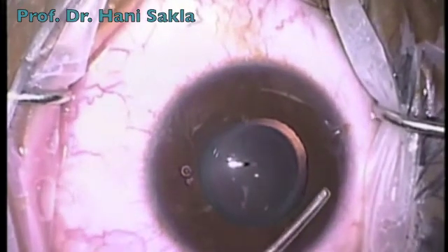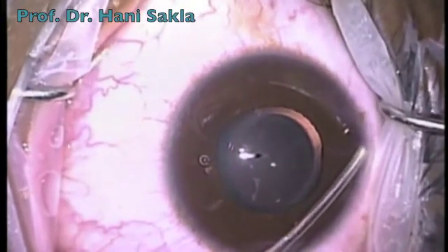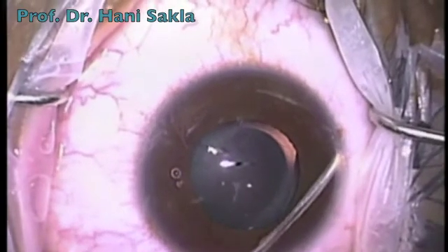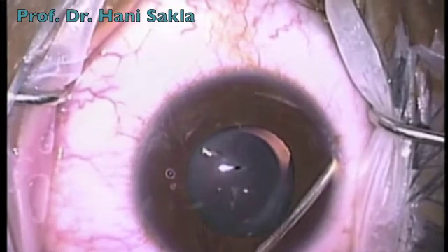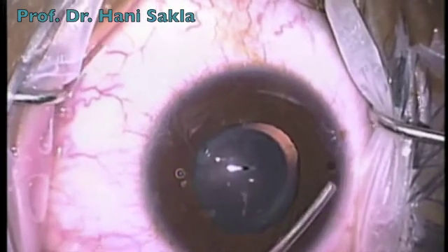Then with the vitreous cutter, we perform a peripheral iridectomy, which is a very important step in cases of posterior chamber phakic lenses to avoid pupillary block.